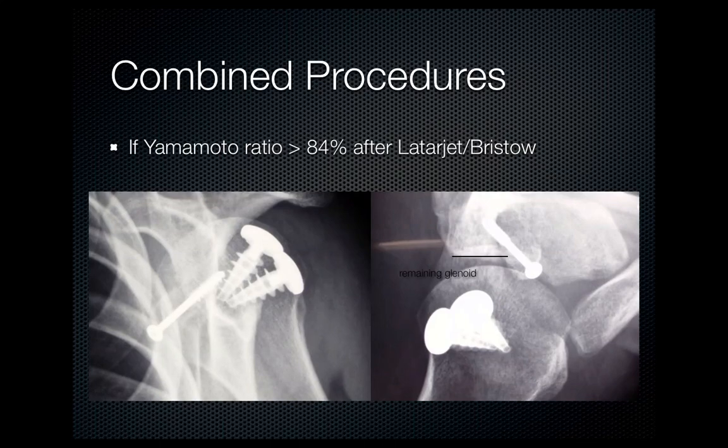If there is both glenoid bone loss and a large Hill Sachs, we determine the combined width of the planned glenoid coracoid reconstruction. If the Hill Sachs width is still more than 84% of this combined reconstruction, then a HemiCAP is inserted.